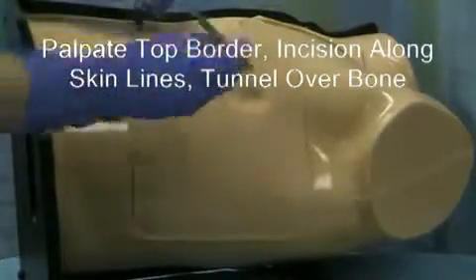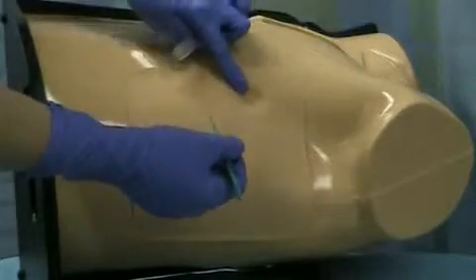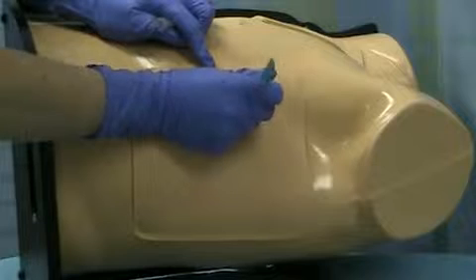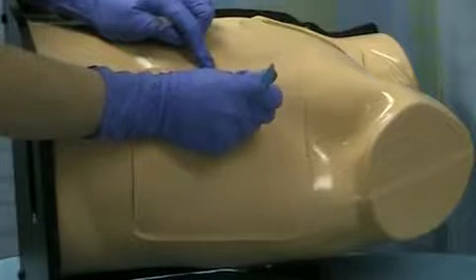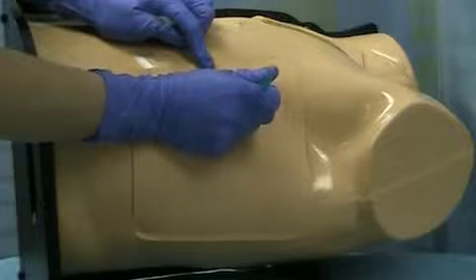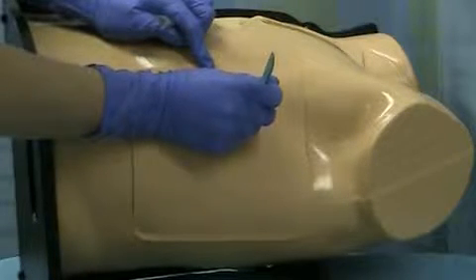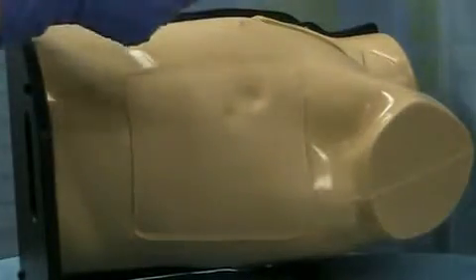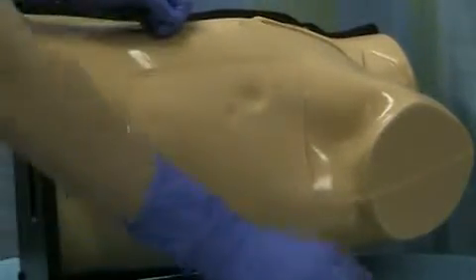Using my 11 blade, making sure I'm in the anterior axillary line, I go ahead and make an incision down to the bone. I can feel the bone. Now you need to make an incision that's big enough for your tube to get in. It's more important that you make an incision big enough and easy enough to work in than it is to make it small enough that it goes around your tube.